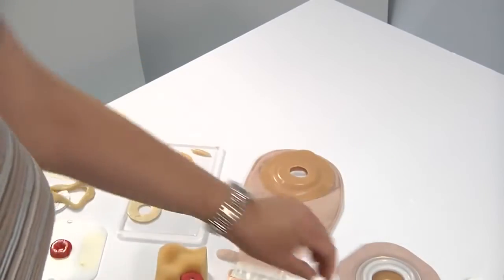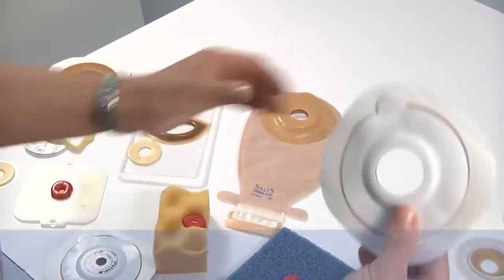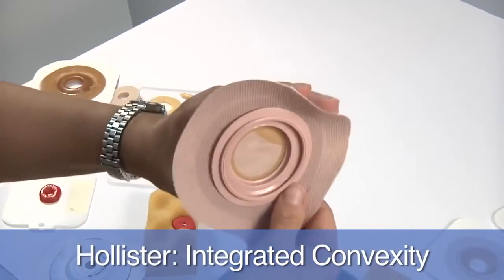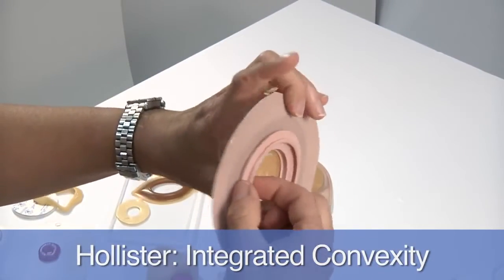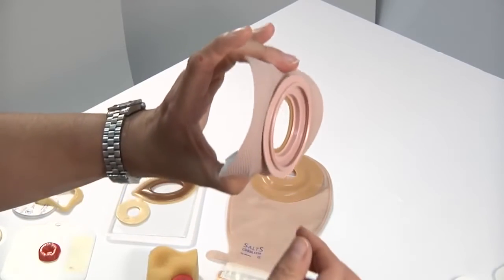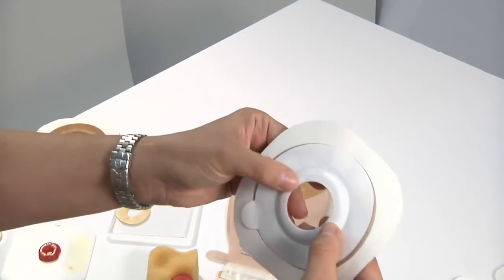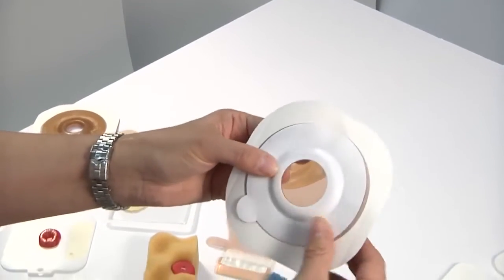Hollister has two types of convexity. So their first one here would be this one, which is, again, their integrated convexity. But with this one, you're going to see quite a bit of a difference between that and what we just first saw with the Salts one. This one's actually got a fair amount more rigidity to it. It's really hard to distort. And when you press on it, it's not floppy. It's actually not going anywhere.